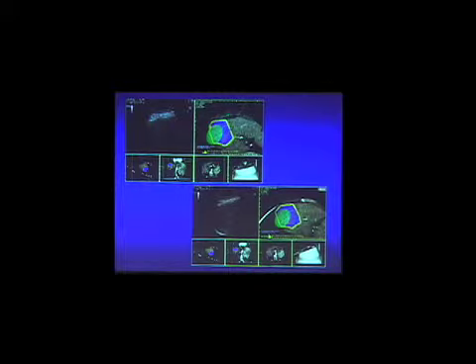You introduce the first antenna and you mark in green where this has been placed. Then you introduce the second one, and in live modality, you measure the distance between the center of this oval shape here and the center of the previous oval. If this distance is approximately 2 centimeters, it means that you can start the treatment and start treating the tumor.